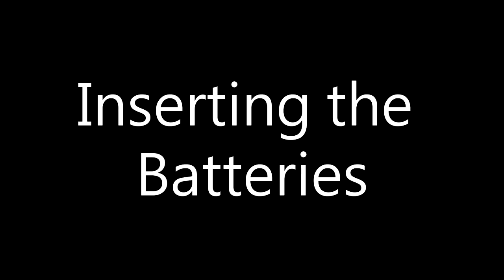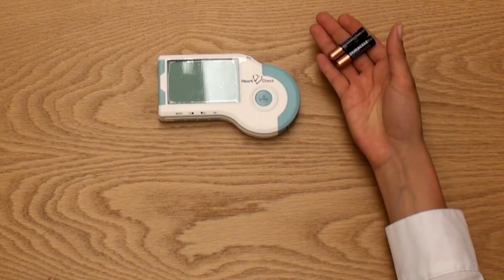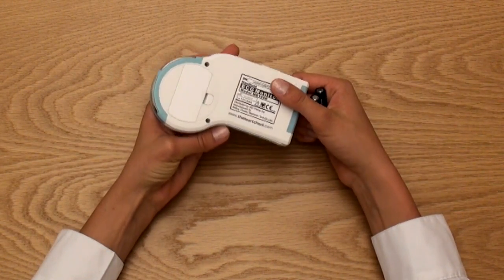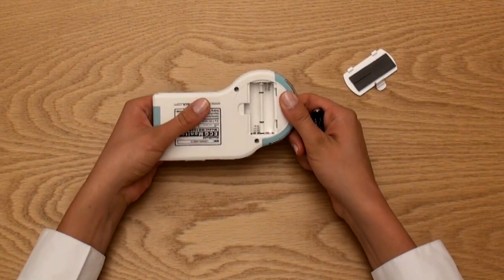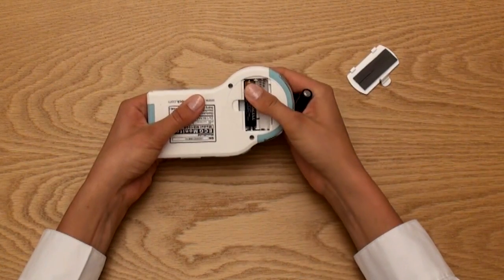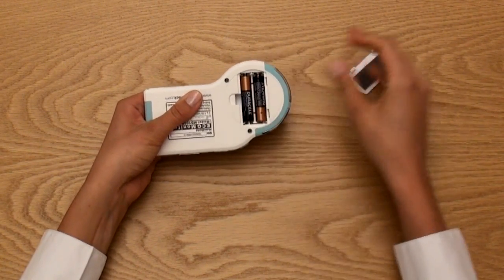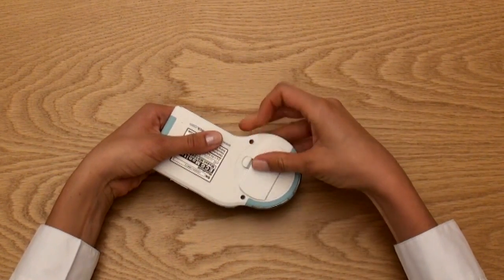Inserting the batteries. When you first open the HeartCheck handheld ECG device, you'll need to install the two AAA batteries included in the package. The battery compartment is located at the back of the device. Simply slide the hinge to the left to remove the battery cover. Install the batteries by lining up the positive and negative symbols on the battery with the corresponding symbols on the battery compartment. Remember to turn off the device before replacing the batteries.